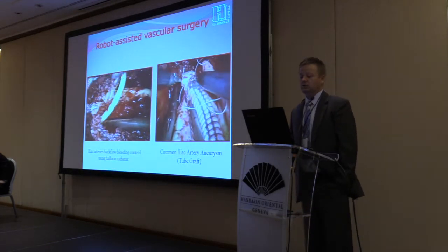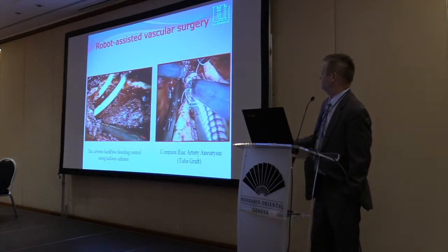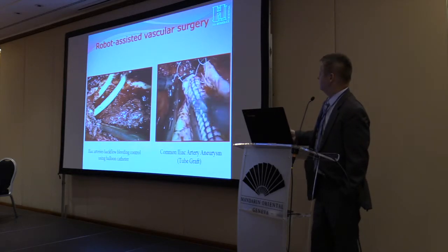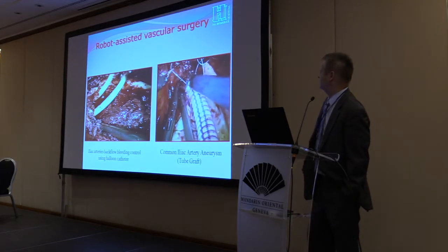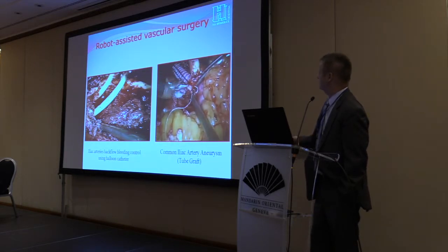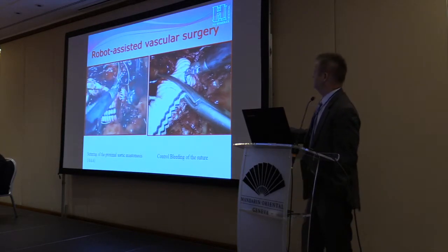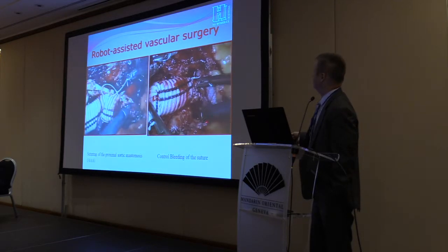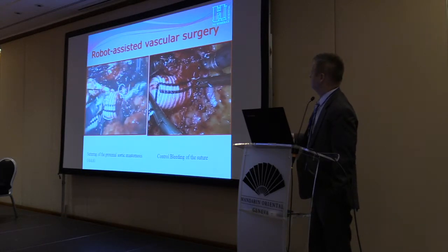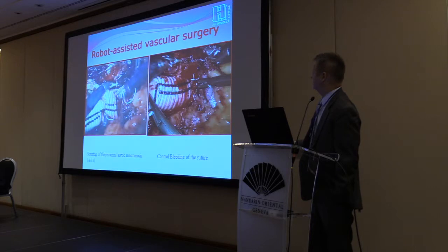Ladies and gentlemen, let me show you some tricks and tips during the second part of the operation. This video shows iliac artery backflow bleeding using two-balloon control catheters. This is one of the rare operations, especially common iliac artery aneurysm treatment by tube graft. It's necessary to perform two anastomoses, of course. After creation of the central anastomosis during AAA surgery, it's necessary to install another prosthetic clamp to check the central anastomosis. If not okay, it's necessary to install a single stitch.